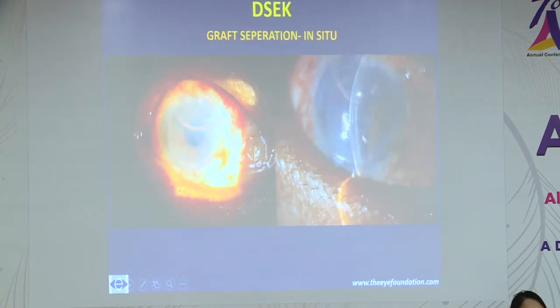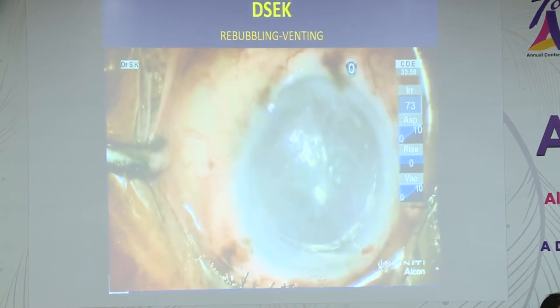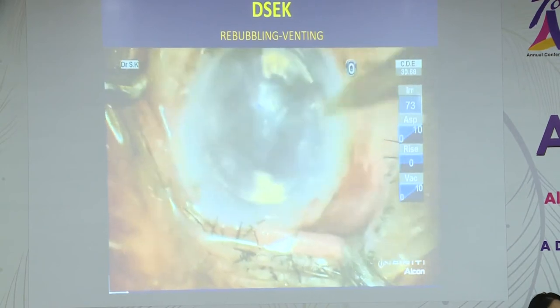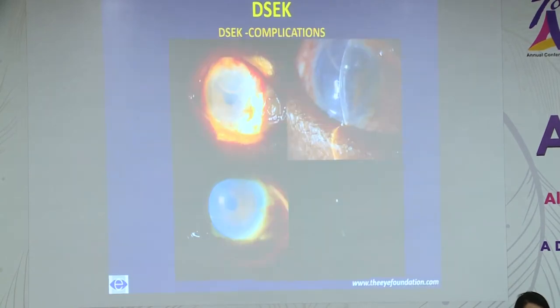Another case, there is a separation of the graft from the cornea, and there is fluid accumulation. The graft is not dislocated or subluxated, but it is in situ, but there is fluid accumulation. This particular patient needs intervention. Many times it can get absorbed spontaneously, but it's better we intervene and inject an air bubble and remove this interface fluid by what are called venting incisions in the paracentral cornea, and milk the fluid from the interface. This is the same patient, a post-operative picture after 6 weeks.